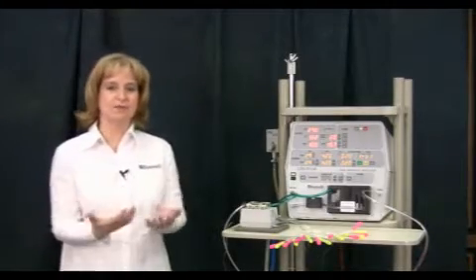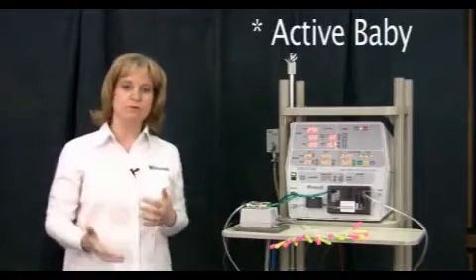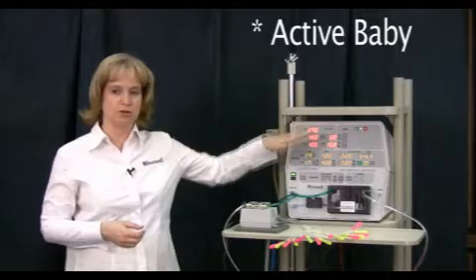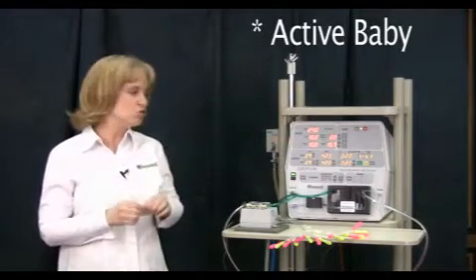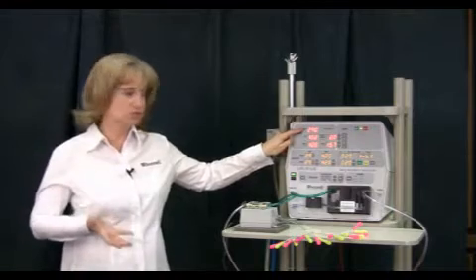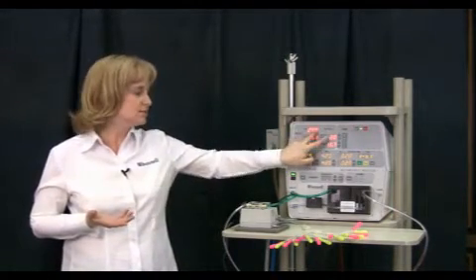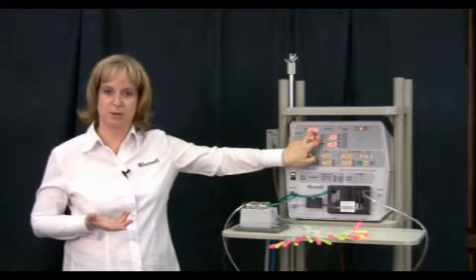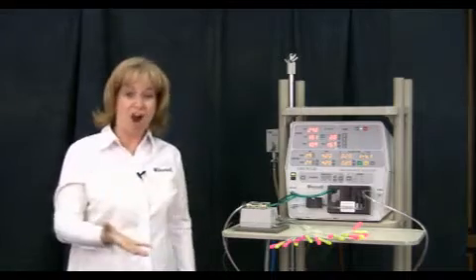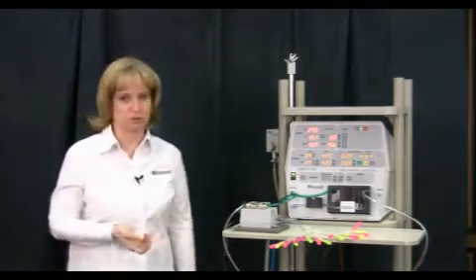All right, now let's talk about things that might cause my servo pressure to fluctuate. If I have a baby that's very active, moving around, breathing on their own, I'm going to see my servo pressure bouncing around. Anything that makes your peak inspiratory pressure fluctuate, you're going to see your servo pressure fluctuate, because it's regulating this. So it's constantly going to adjust if my peak inspiratory pressure adjusts for any reason. So if your baby's moving, or they cough, or they're breathing on their own quite a bit, they're very active, you're going to see big fluctuations there.